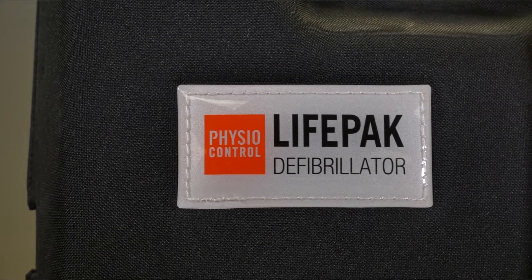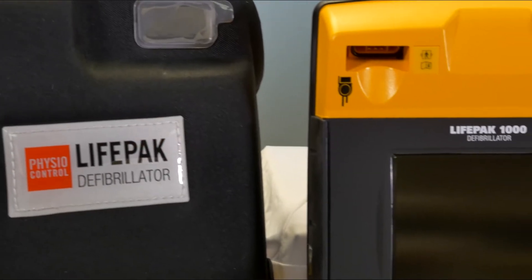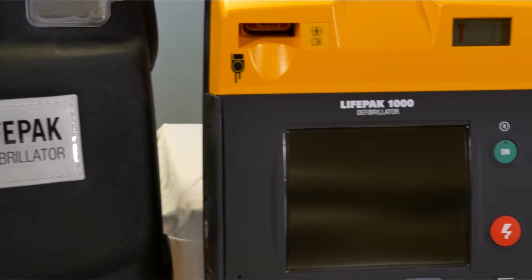The LifePak 1000 is the most rugged defibrillator ever built by PhysioControl with an IP rating of 55, meaning it is highly resistant to both water and dust.